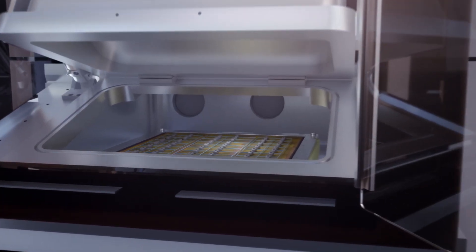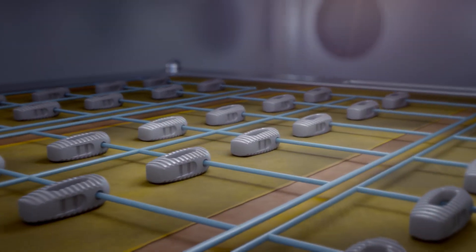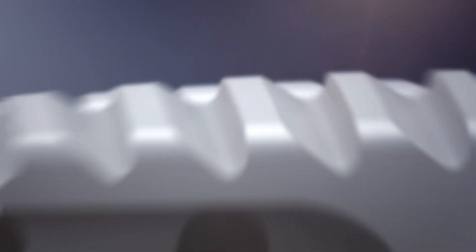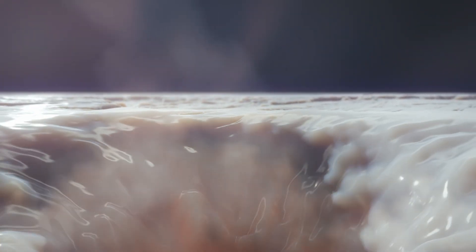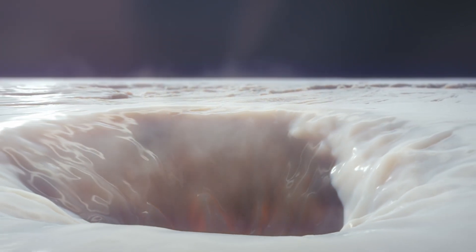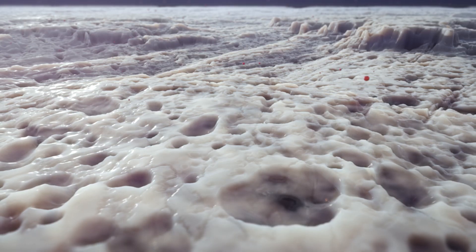The fully automated accelerated neutral atom beam processor is used to create a nanotexture on the surface at the nanoscale. Highly accelerated argon atoms within the processor's beam impact the surface of the PEAK at thousands of miles per hour, releasing a thermal energy spike of a picosecond that ablates organic material, leaving behind nanoscale concavities in the PEAK surface.